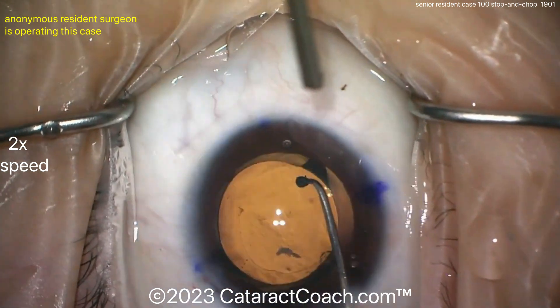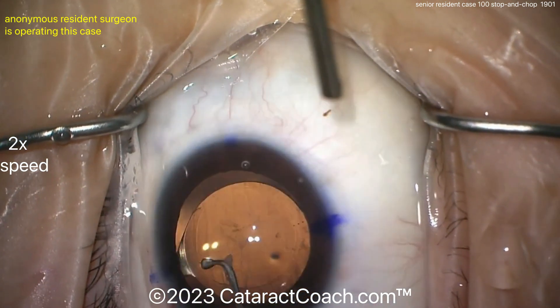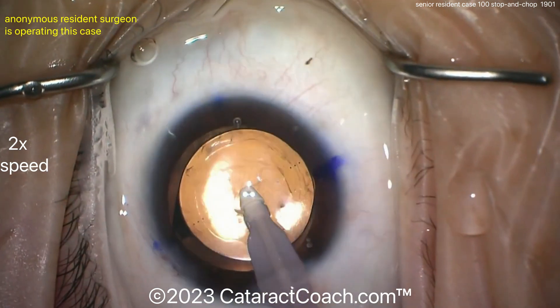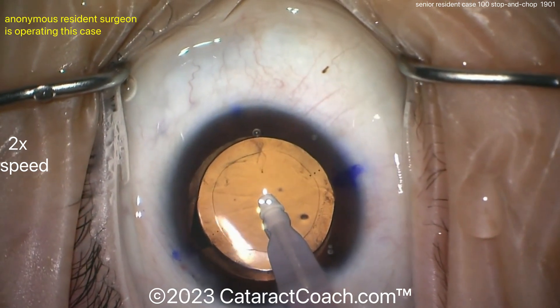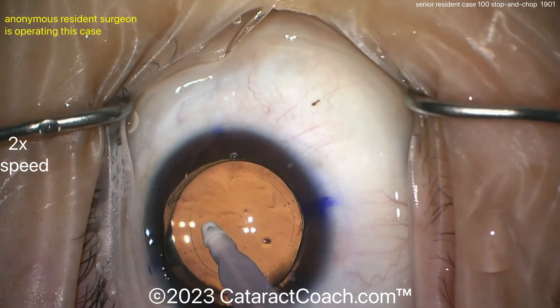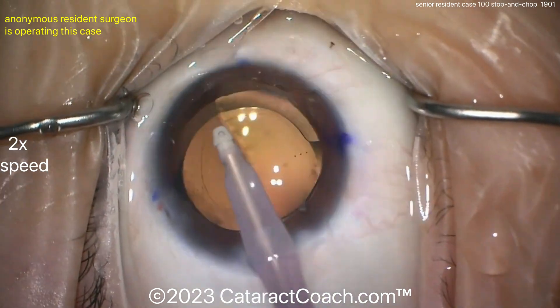The stop-and-chop was beautifully done. Look at the rhexis overlap — that looks fantastic, about a 5-ish millimeter rhexis, that looks beautiful. Getting that lens into position. I usually place the lens a little before the actual marks, then remove viscoelastic. This is important with a toric lens: please go behind the optic and remove viscoelastic. You don't want to leave viscoelastic behind the optic, because viscoelastic between the optic posterior surface and the posterior capsule can cause lubrication and make the lens slip out of position.